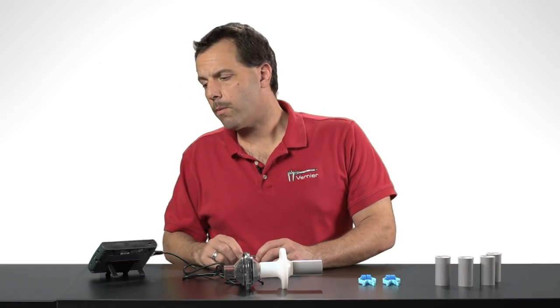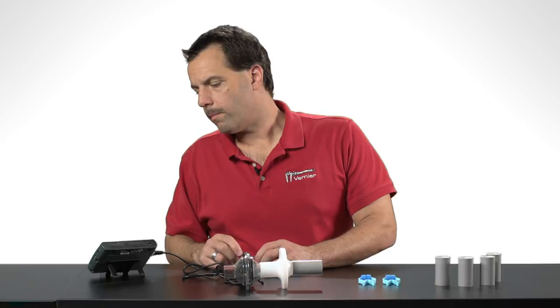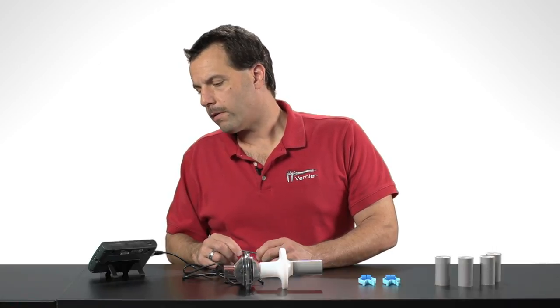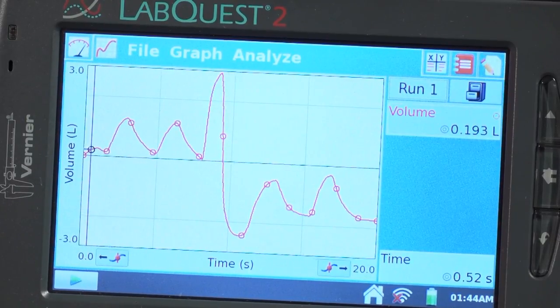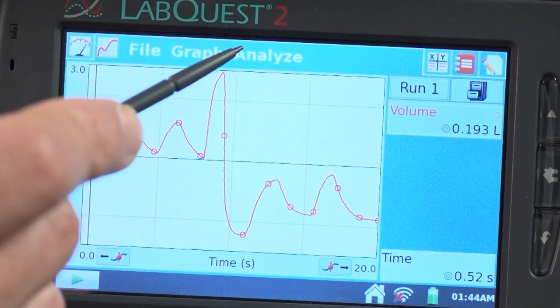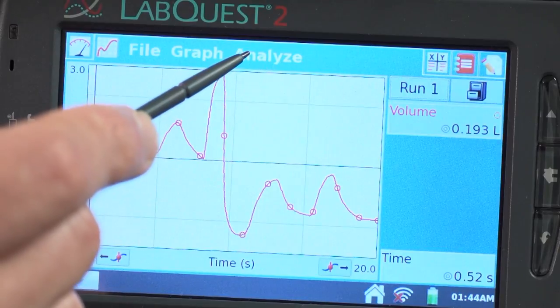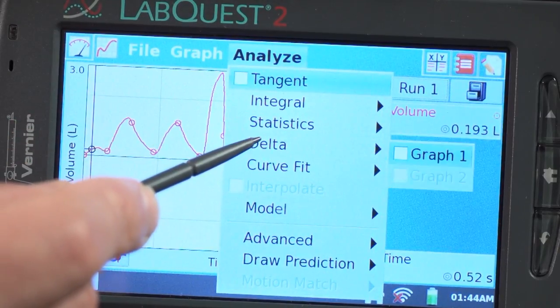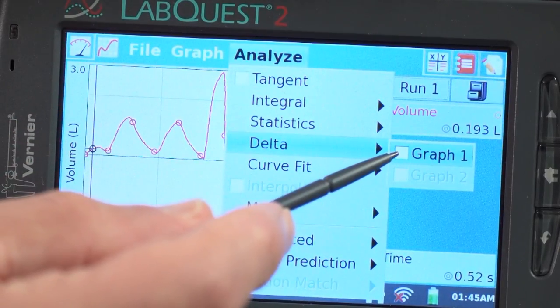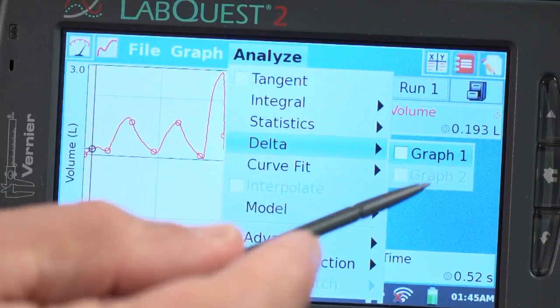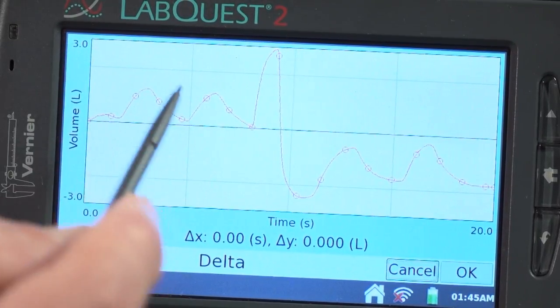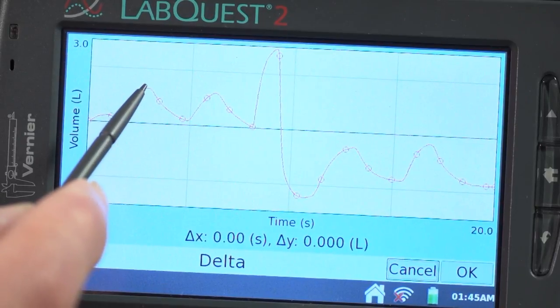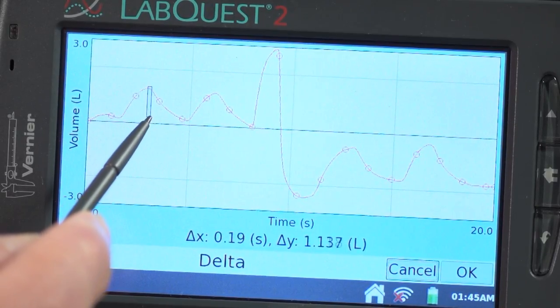Now there is another way to calculate tidal volumes or to look at the difference in an X and a Y coordinate if I make a selection. And that's using what we call the delta window. And if I go to Analyze here, I can also go to Delta. I'm going to select Graph 1 because Graph 1 is on volume.